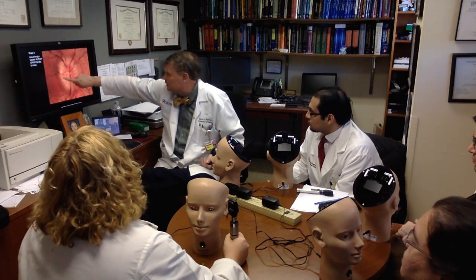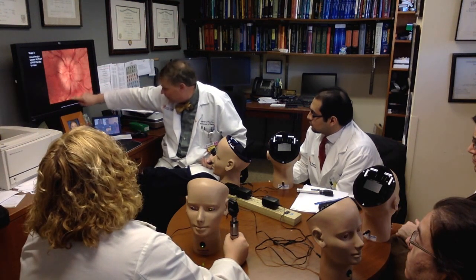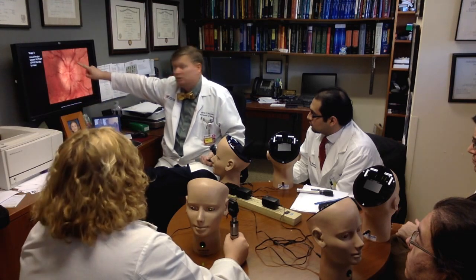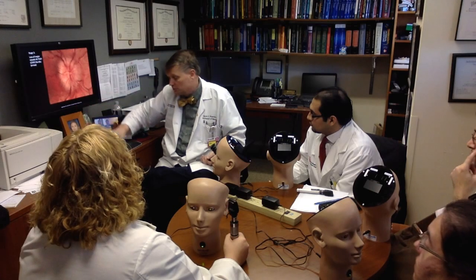Now, here is grade 3. Oh man, the disc is clearly blurred. Look how it's elevated here. The vein runs down and then out. But you're starting to lose some blood vessels in all the edema as it goes through.